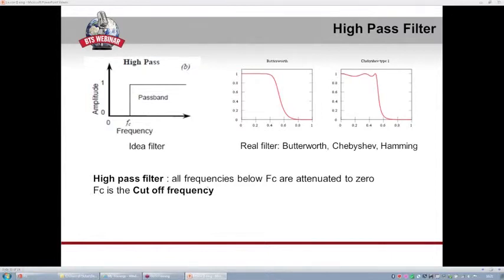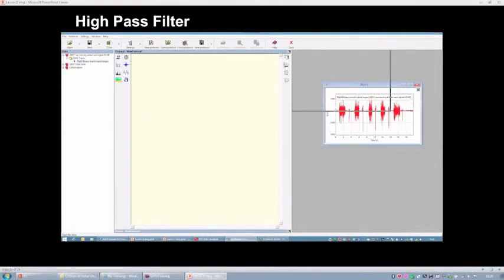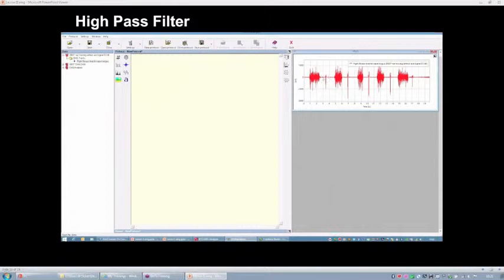Let me now show you how to apply a high-pass filter to a signal by means of our application. In this example, I have voluntarily created some low-frequency artifact noise, which is what I'm showing on this graph. Now I want to show you the result of a power density spectrum of a signal containing a very huge amount of artifacts like those. Okay, so now I'm defining the time duration of the epoch to compute the spectrum. Again, 500 milliseconds. This is the signal that I want to use.